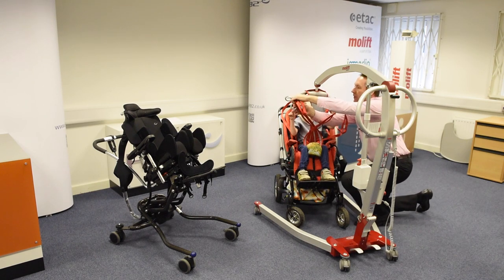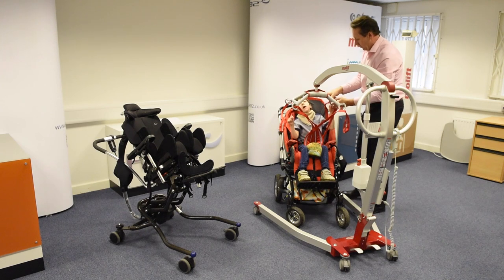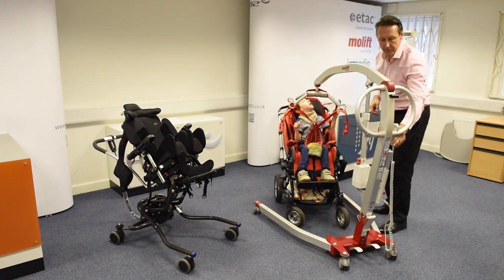It's not going to crunch you up in the middle, your tummy. We've got these long loops on the shoulder, which will cope with any extension you might go into during the transfer.